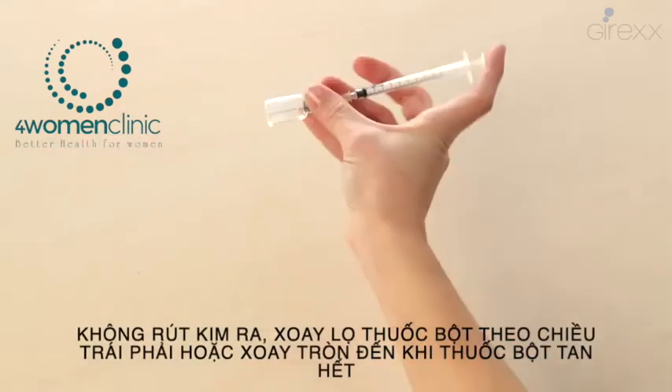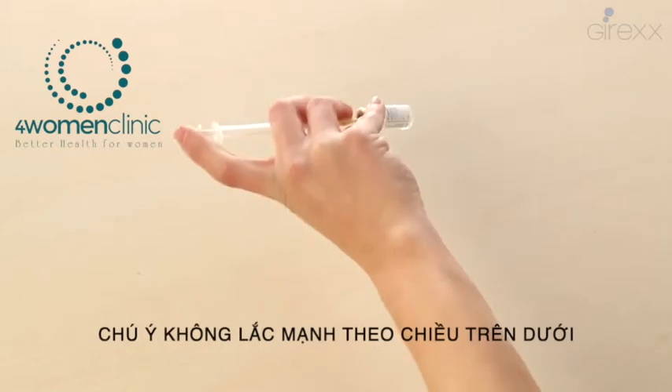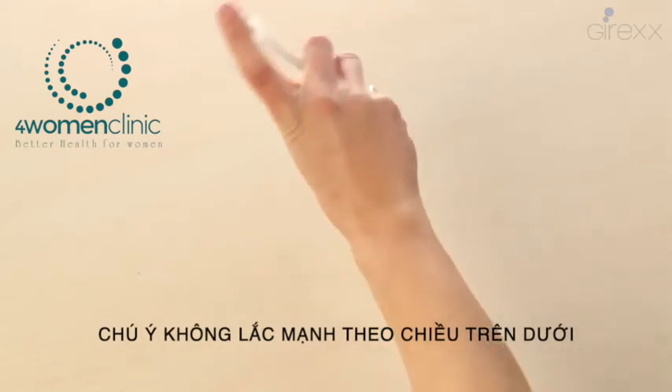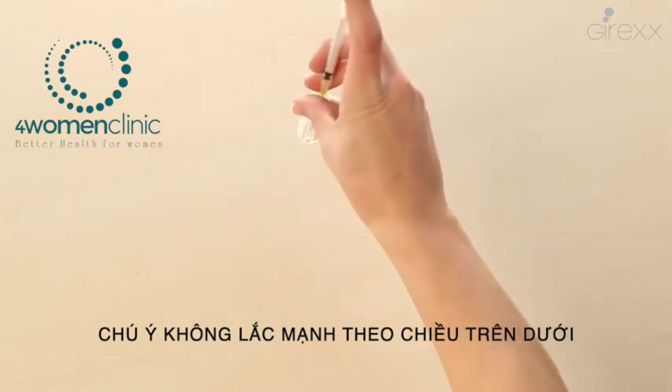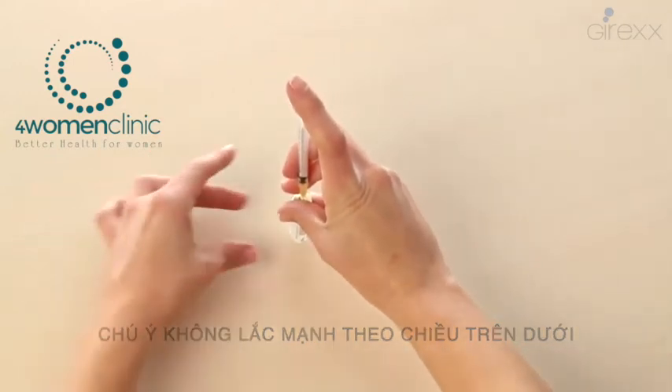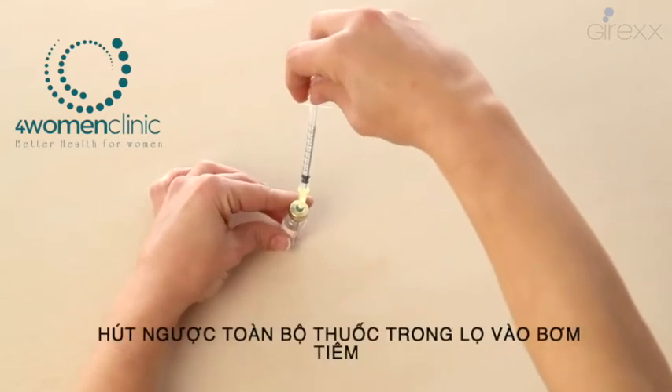Holding the syringe and the plunger at the same time, mix the content with a gentle hand movement. Avoid shaking it in an energetic way. Then lean the vial slightly on the table and introduce the needle to the end of the vial.